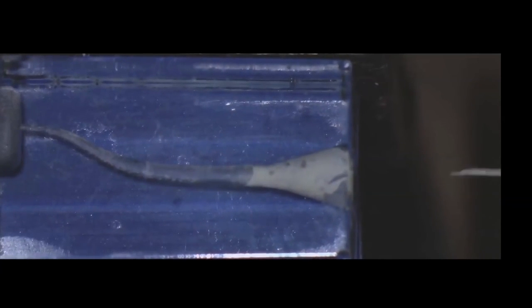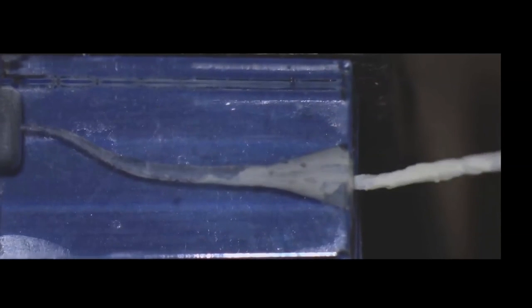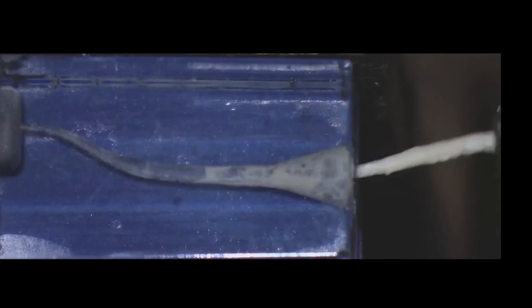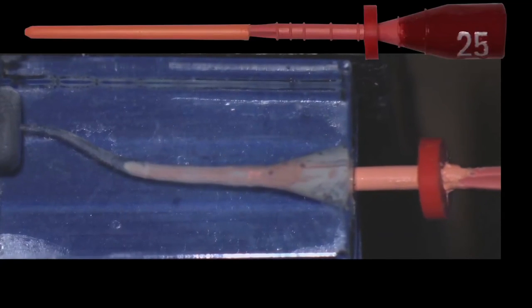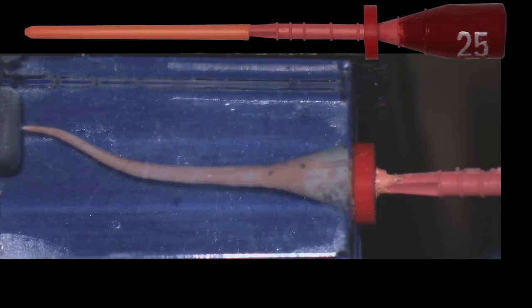Then we remove the excess of cement. It has to be a very, very fine layer of cement. We use cements, and then we insert the core obturator until it reaches working length. You have seen how easy it is to fill the canals also in this case with GuttaCore.